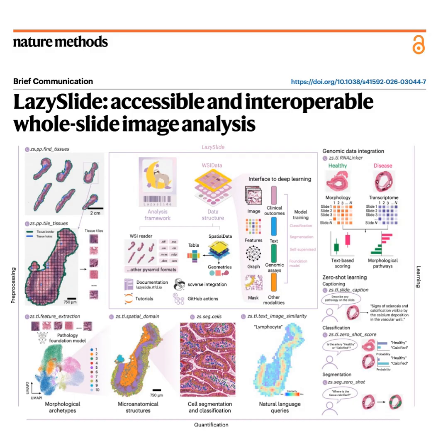Yeah. And with the cells perfectly mapped and the visual features translated into math, LazySlide then runs something called Leiden community detection. That's a clustering algorithm, right? Yes. It looks at the mathematical vectors of all these tiles and groups the ones that are statistically similar. So without a pathologist ever having to manually annotate a slide. The algorithm autonomously groups the tiles into biological neighborhoods, like automatically mapping out the mucosa or the lymphoid tissue. Exactly. It derives the entire organ architecture purely from the mathematical relationships.